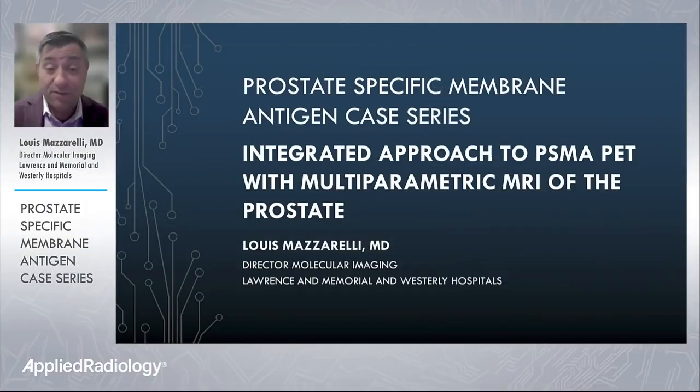I'm Dr. Louis Mazzarelli, Director of Molecular Imaging at Lawrence Memorial and Westerly Hospitals. This is the prostate-specific membrane antigen case series, and this is an integrated approach to PSMA PET with multiparametric MRI of the prostate. Let's get into this.